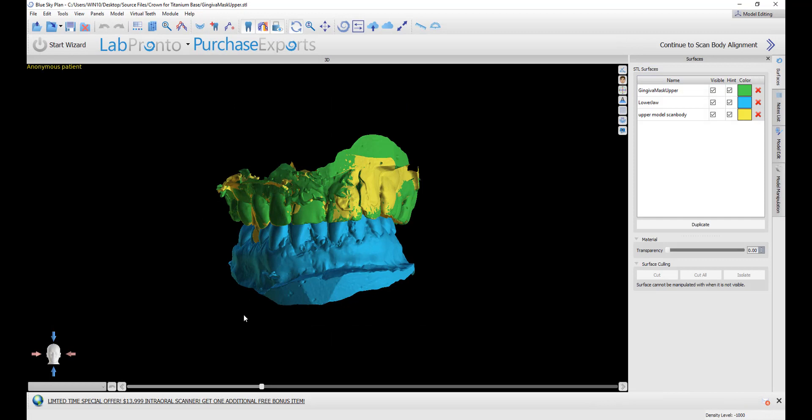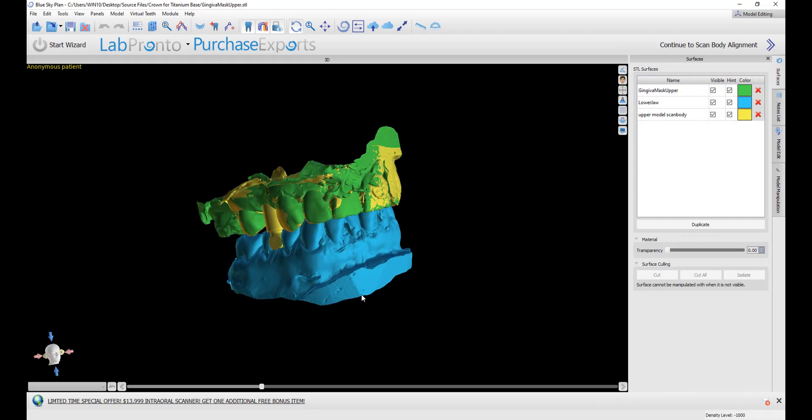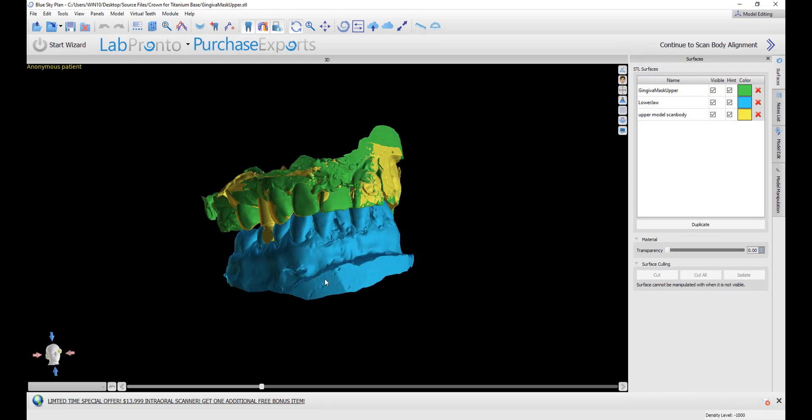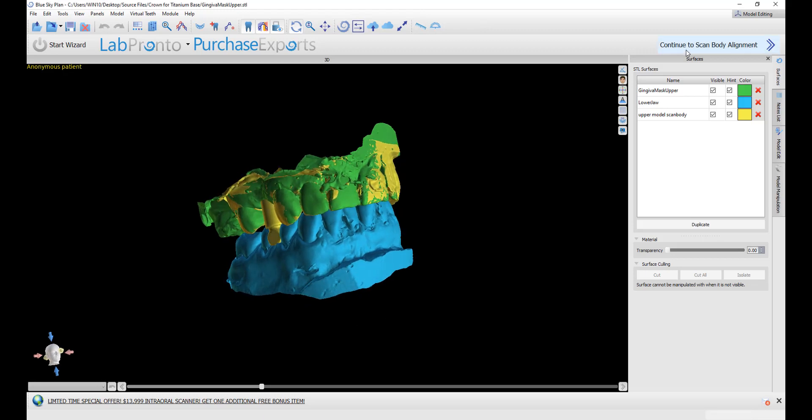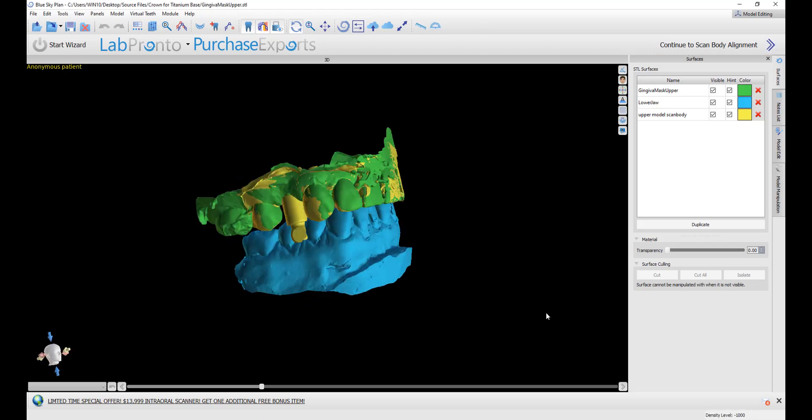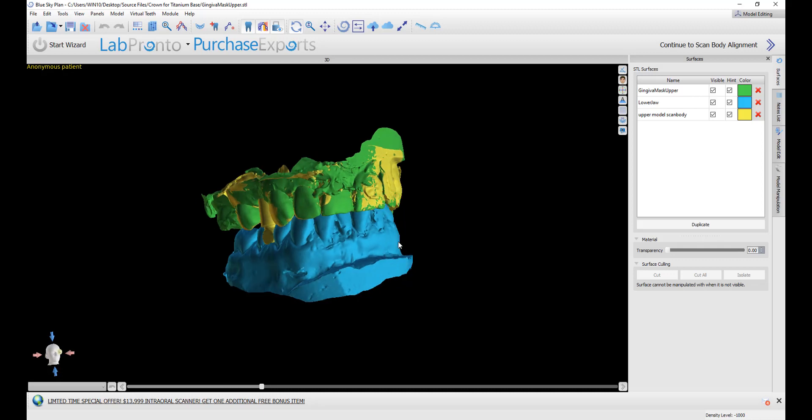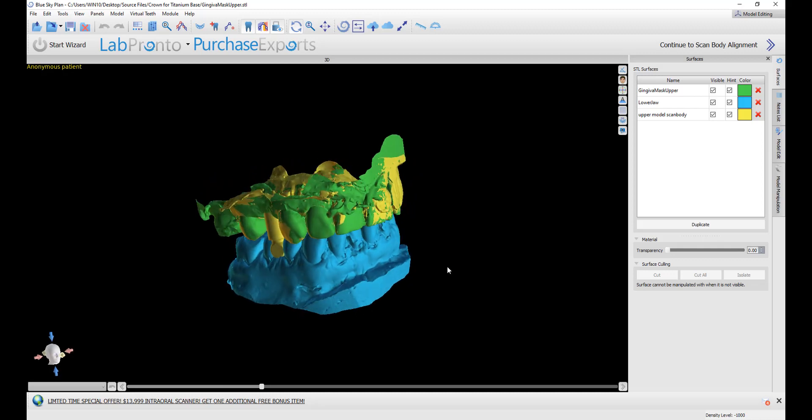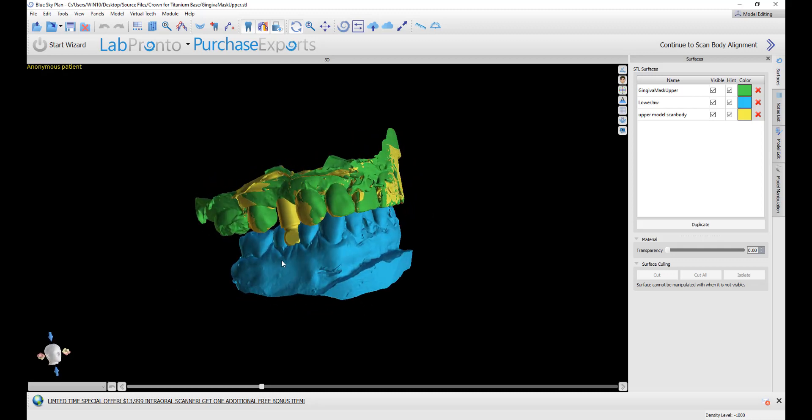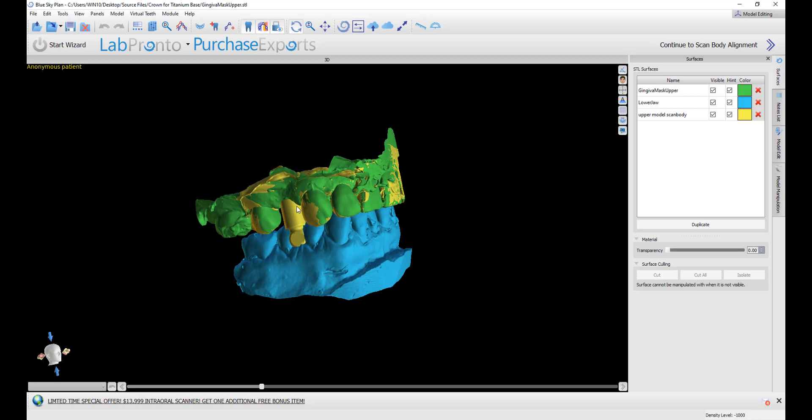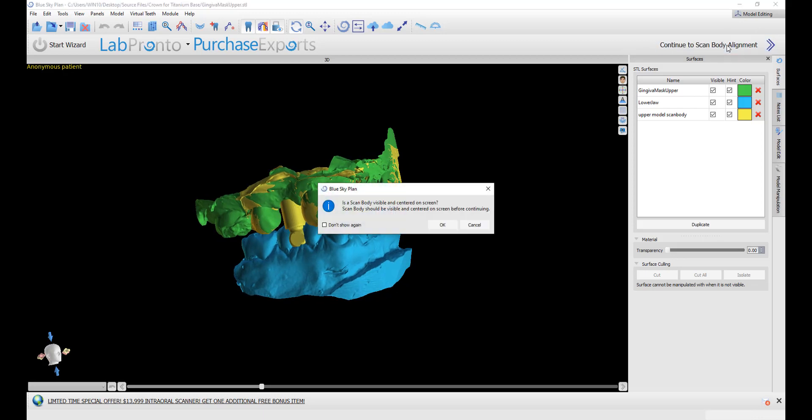We've now imported our surfaces into the Blue Sky Plan software. Before continuing by pressing continue to scan body alignment, we are going to make sure that our scan body is visible and we could see the flat part of the scan body, assuming that there is one. We could rotate by holding down our left mouse button and just grabbing and dragging. Once we have the scan body visible, we click continue to scan body alignment. This reminder is again reminding us that the scan body is visible, since the next step is going to open a screen for us to select the scan body and the tooth. If we don't want to see the message again, simply click don't show again and then click OK.